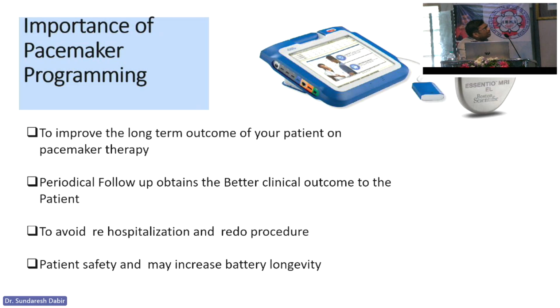So, what are our benefits? When you do the programming, it improves the long-term outcome of patient pacemaker therapy. Periodical follow-up is very important, as I told you, to avoid re-hospitalization, and redo procedures can be avoided, right? It's all in our hand. And it improves patient safety and may increase battery longevity.